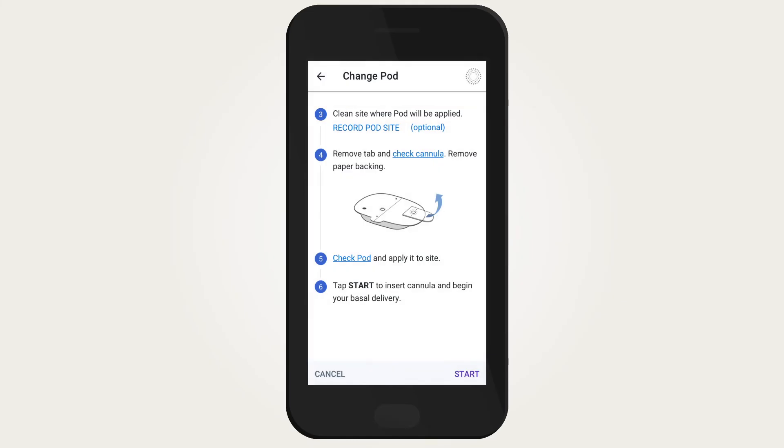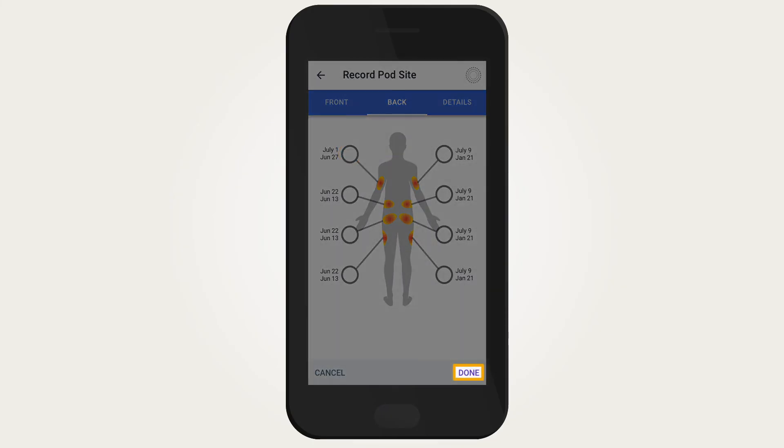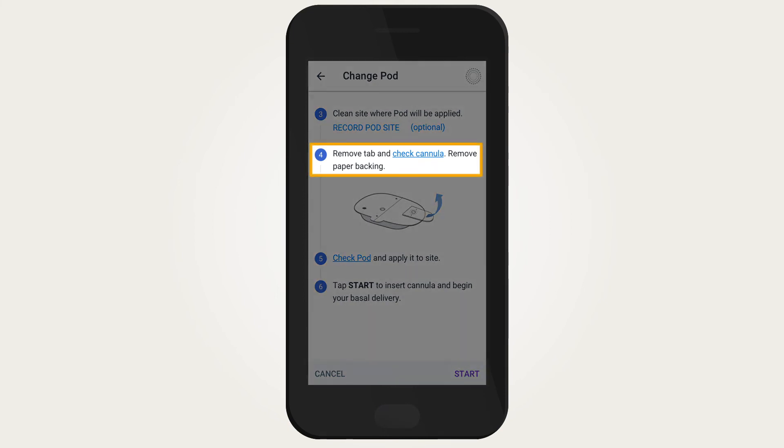The pod site map is an optional feature to track current and recent pod site locations. Tap 'Record Pod Site' to use this feature, then tap 'Done' once the site is recorded. Follow the next steps on the screen.